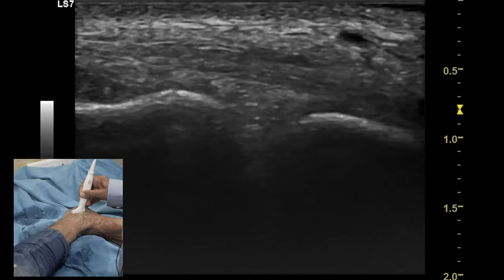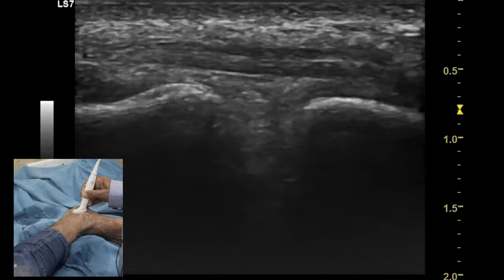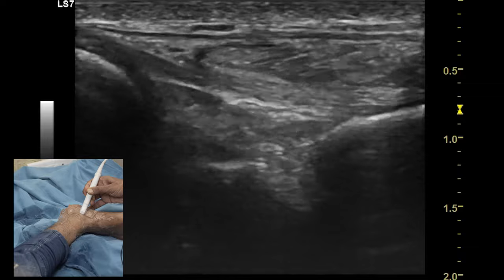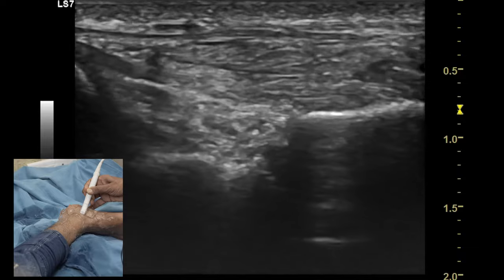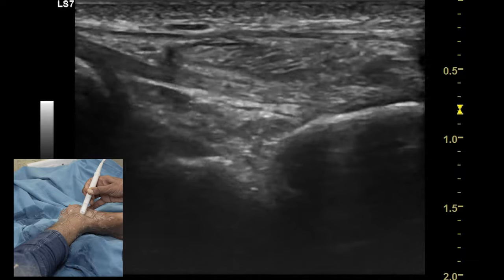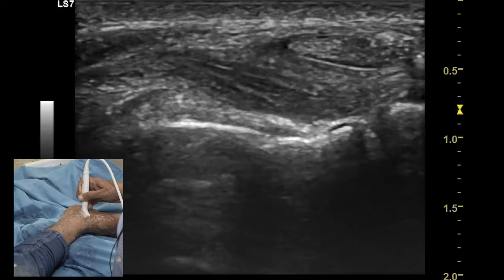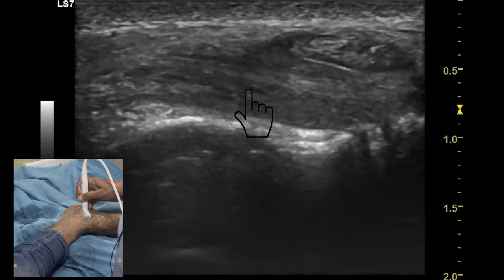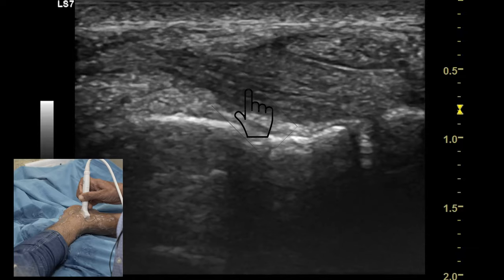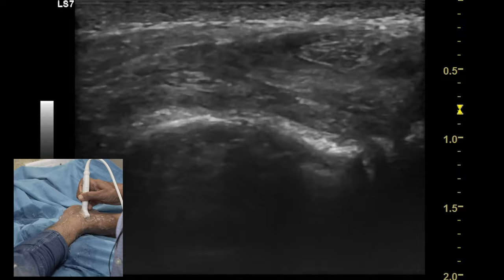By connecting the medial malleolus and the sustentaculum tali, the tibial calcaneal component of the deltoid ligament is identified. By connecting the medial malleolus and the navicular bone, one can identify the anterior component of the deltoid ligament — the tibial navicular component. The spring ligament, or the calcaneonavicular ligament, is identified along the long axis lying just below the tibialis posterior tendon appearing in transverse view. Keep in mind that only the superficial component of this ligament can be seen.